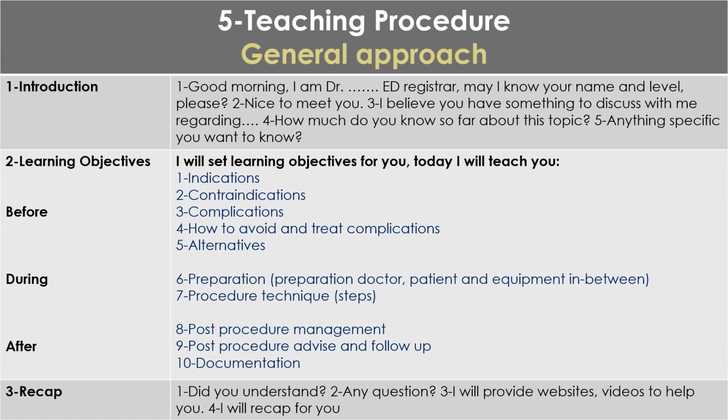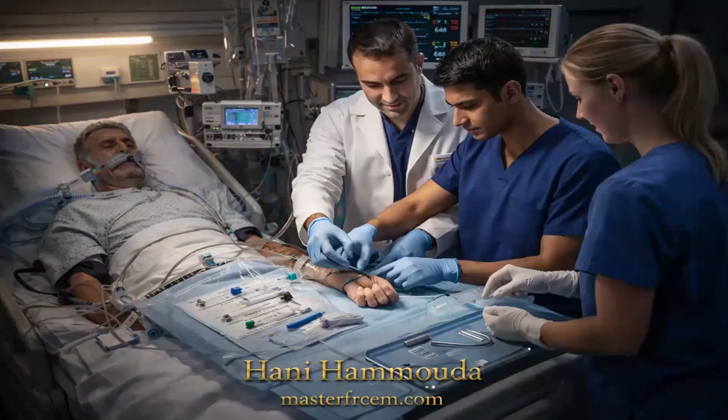So let's get started. When we talk about indication, we cite arterial line in the condition where we want to do invasive blood pressure monitoring or continuous sampling or continuous ABG monitoring for a sick patient.